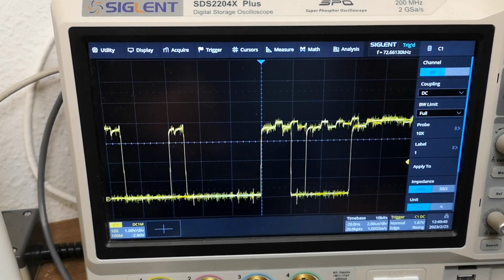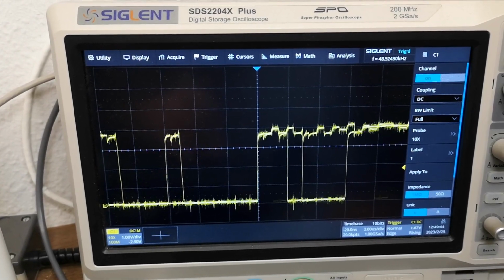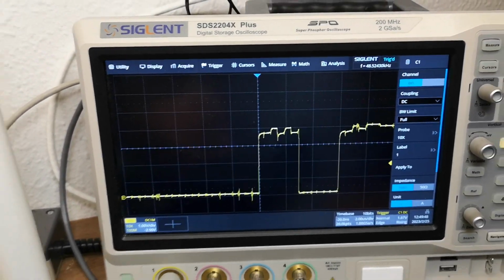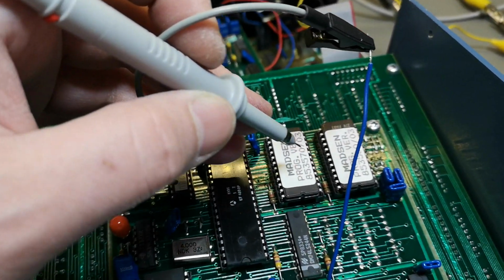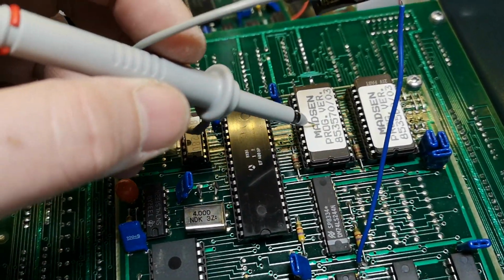And this is kind of coupling to that one, right? That is funny. Can of course also be some leakage problems, but I bet it has something to do with the layout technique.